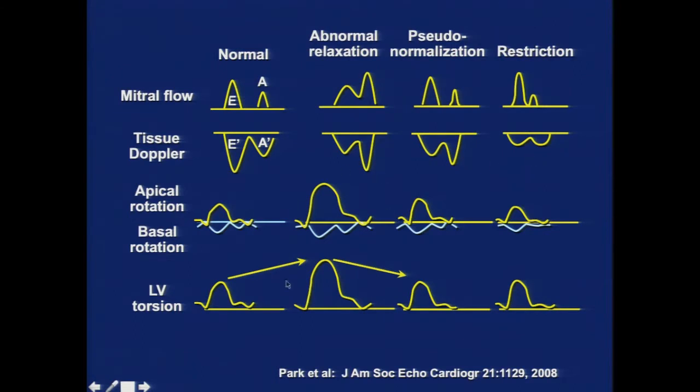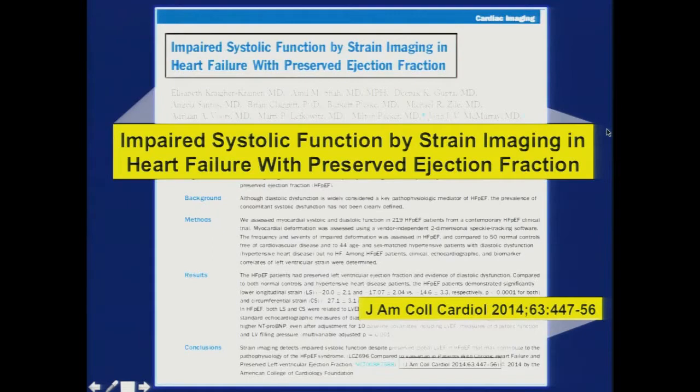Rotational dynamics, which are influenced by the epicardial fibers of the heart, early on may in fact be augmented in an effort here to maintain systolic performance. And it's really not until later in the stages of disease, when you see a reduction in both longitudinal and rotational dynamics, that you begin to see the hemodynamic impact of increase in filling pressure. And clinically, this may be useful.